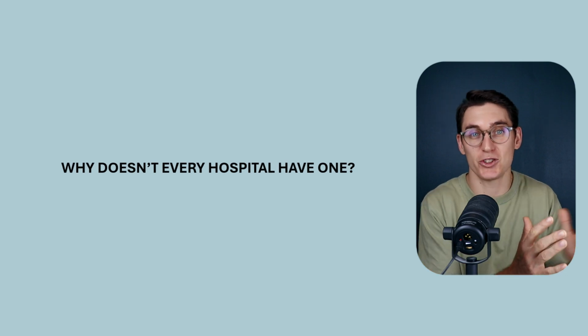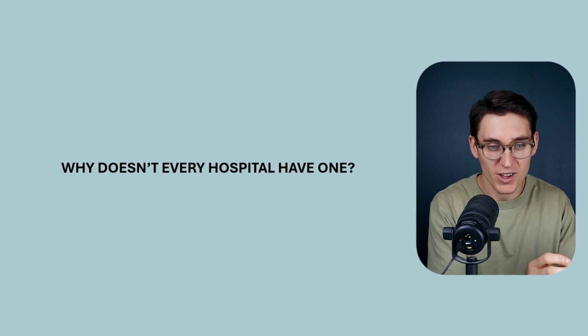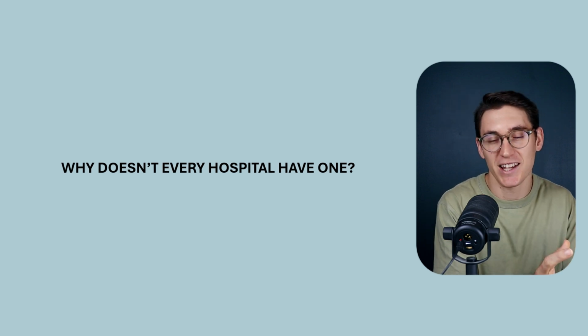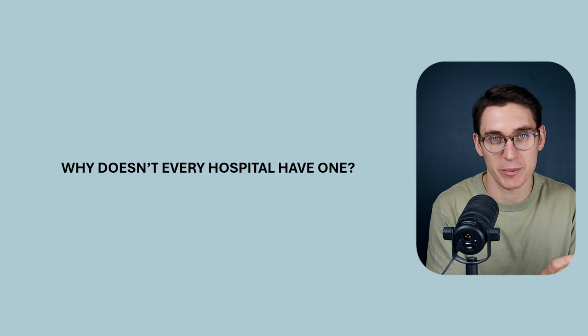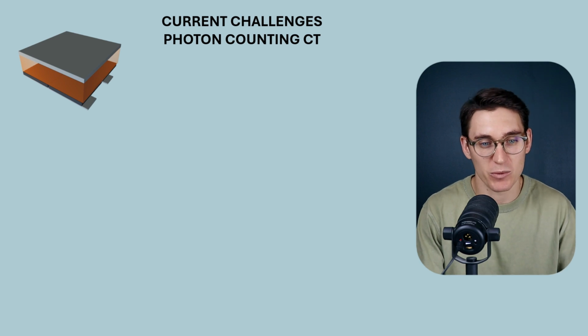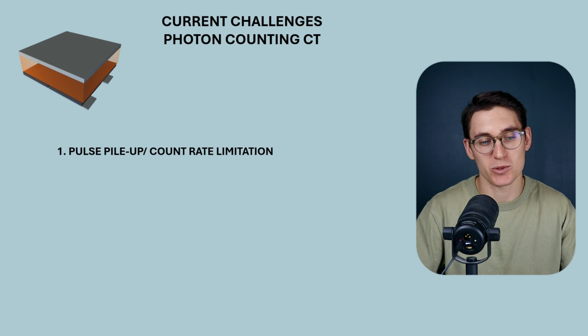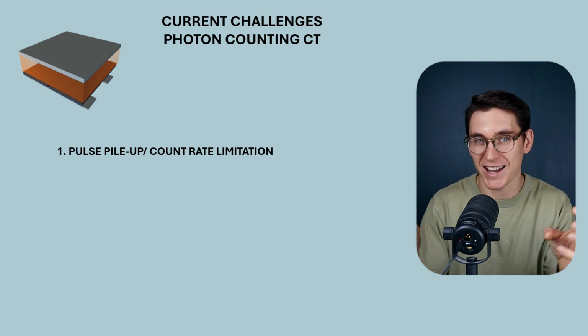Well, firstly, this is a new technology. It was only approved in 2021 by the FDA. And obviously, new technology is expensive, so that's always going to be a prohibiting factor. But there are actually certain challenges that photon counting CT detectors face that we still need to overcome or still need to improve on. The first challenge that we face is what's known as pulse pileup, or a count rate limitation.